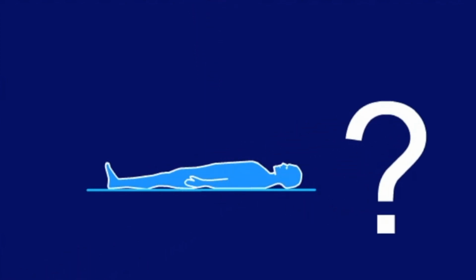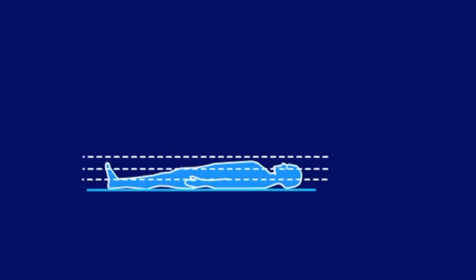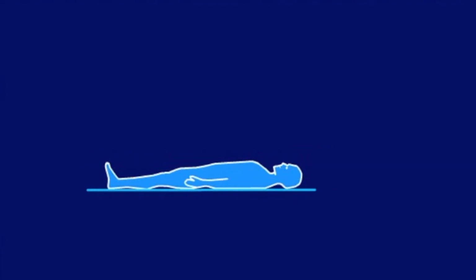How can we know that? The trick is really quite simple. We do not put the patient into a magnetic field which has the same strength all over the section of the patient which we want to examine. Instead, we take a magnetic field which has a different strength at each point of the patient's cross-section.